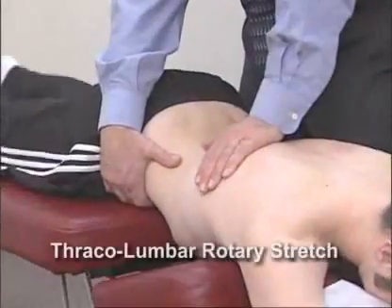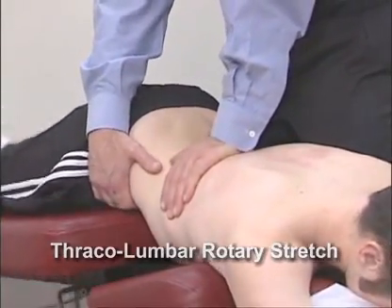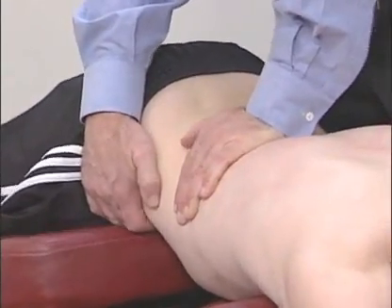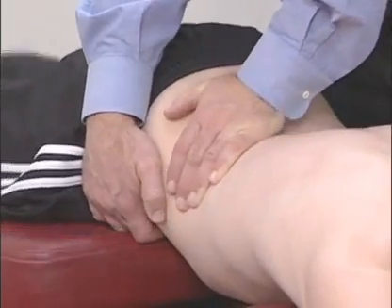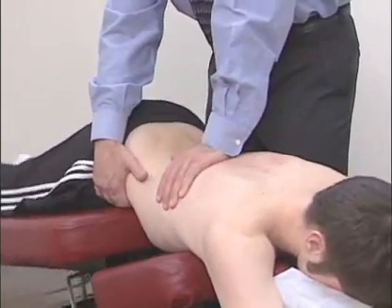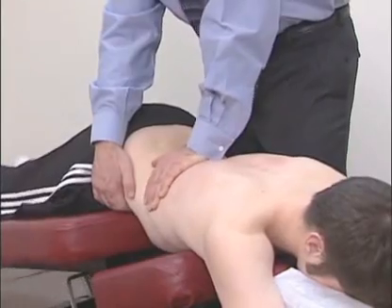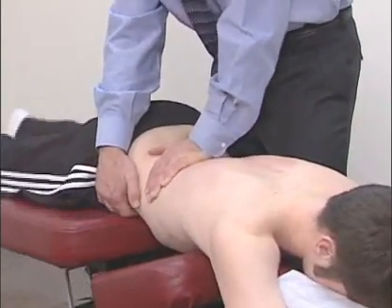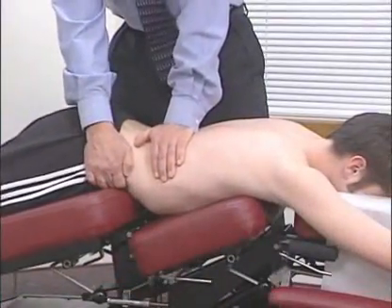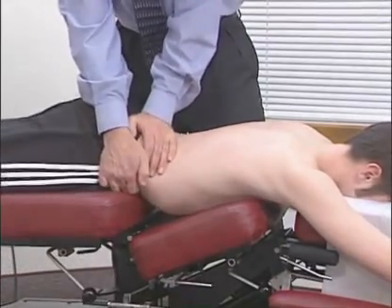The thoracolumbar rotary stretch is applied by standing on the opposite side of the patient. Grasp the anterior ridge of the iliac crest with the inferior hand. With the superior hand, use a firm palm-hand contact along the erector spinae muscles, starting with the upper thoracic spine. As the caudal section of the table descends, simultaneously pull upward with the inferior hand and push down away from the spine with the superior hand. Decrease pressure when the caudal section ascends. Move the superior hand downward along the thoracic and lumbar spine. Repeat on the other side of the spine.